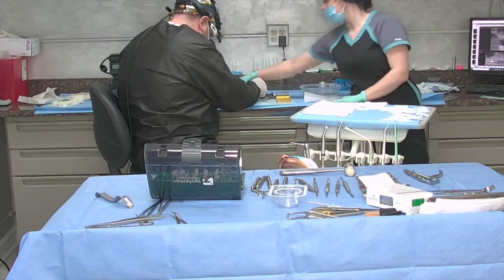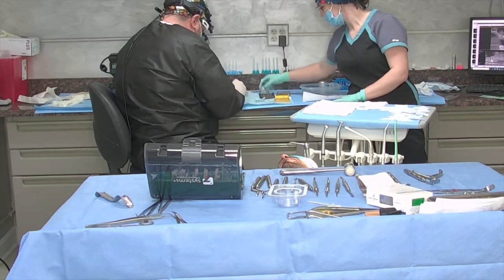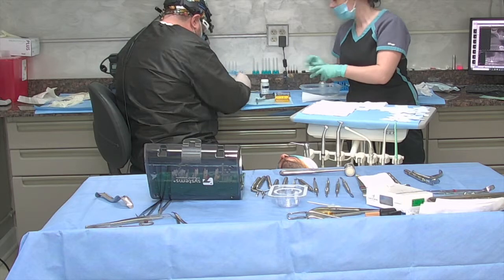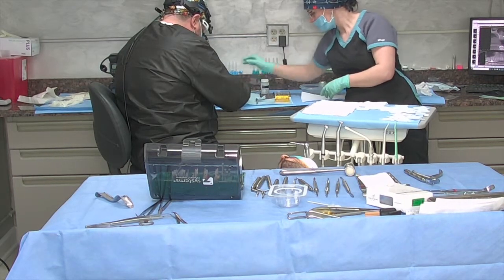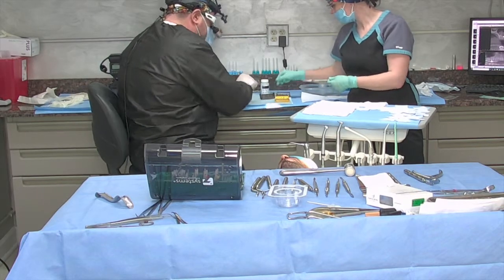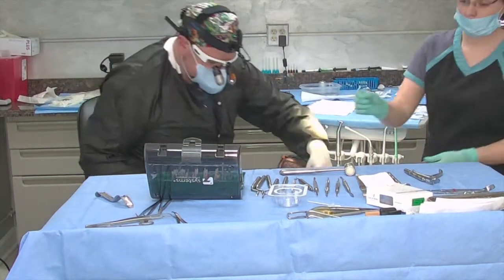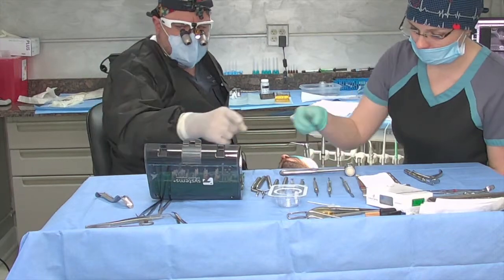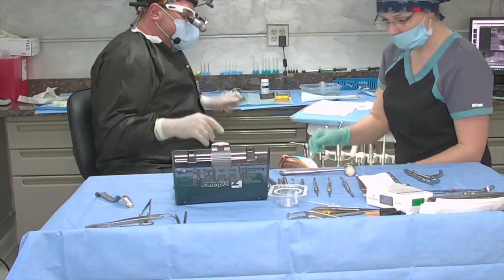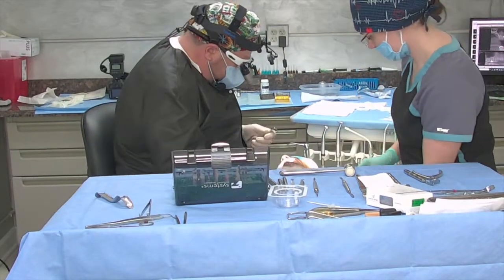Get our graft constituted. And we're not going to put a lot, just up there. Membrane, this graft is going to go right into that buccal area. You know, I'll use the seating. Yeah, I'll use both. I'll go with that and then the other thing. Okay, perfect. Thank you. All right.